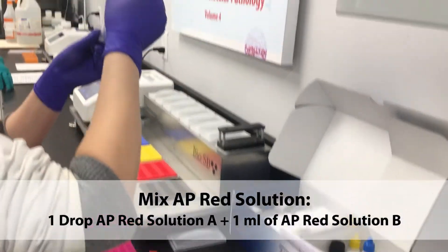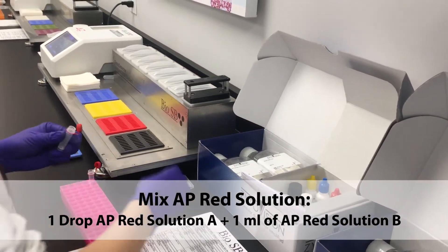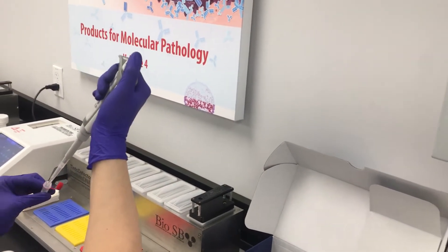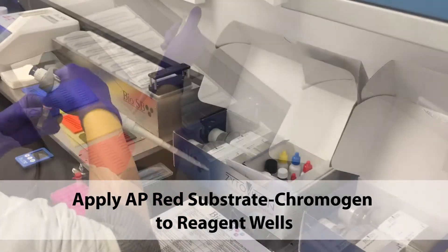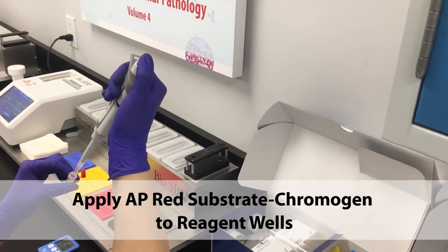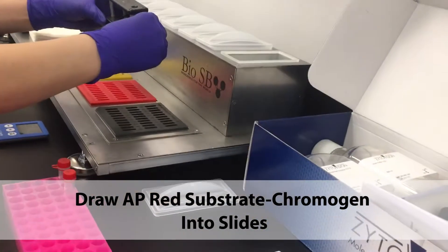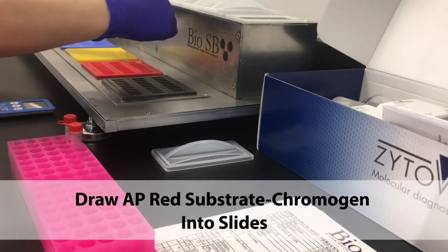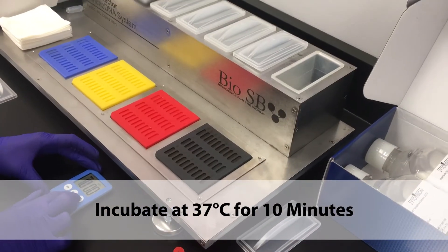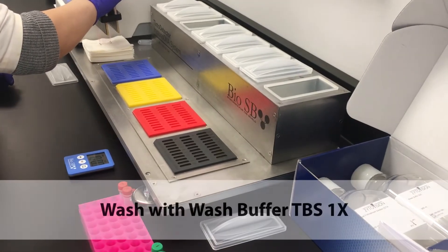With the slides resting, mix the AP Red solutions and apply the AP Red substrate chromogen to the reagent wells. Draw the AP substrate chromogen into the slides and incubate at 37 degrees for 10 minutes. Wash with wash buffer.